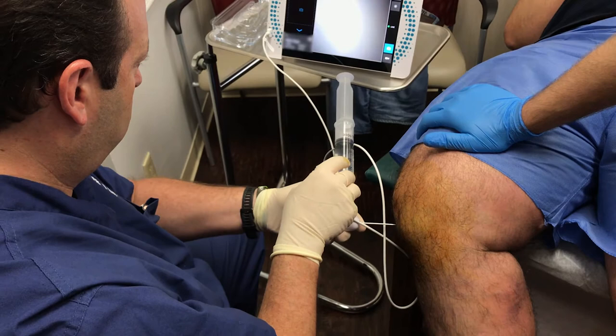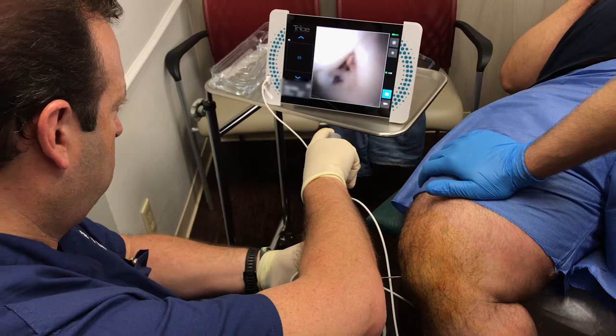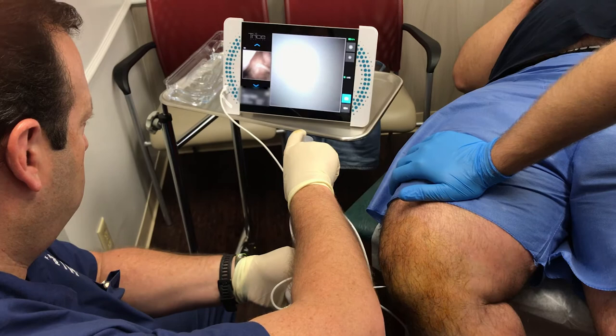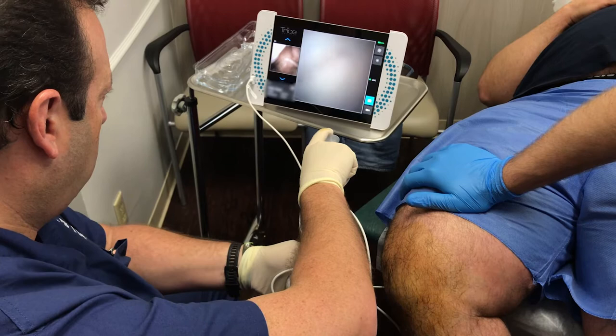Is the scope already in? Yeah, turning in. So there's his ACL. Got a lot of junk in there — a lot of crud, little scar tissue and stuff. Well, remember, we know you had a little bit of arthritis in there, right? We've talked about that. But that's going to happen. We're in the joint, we're in your knee. We've already seen your ACL.